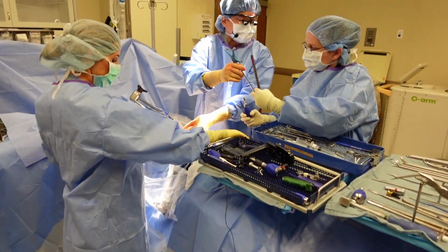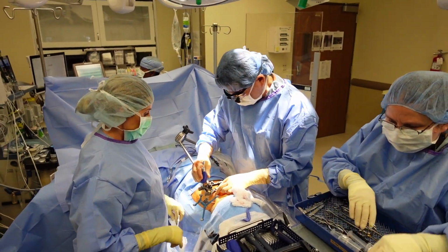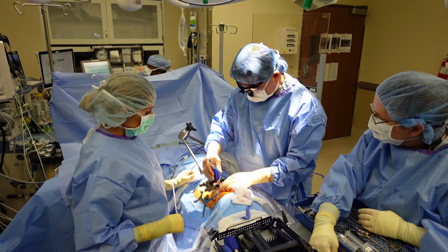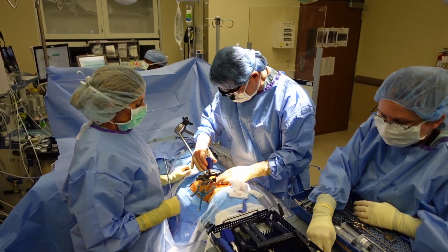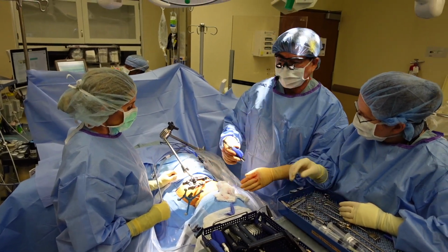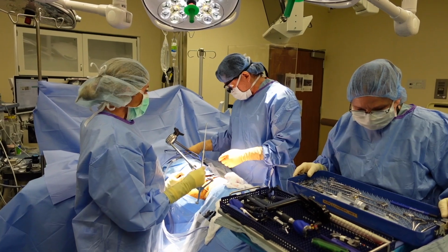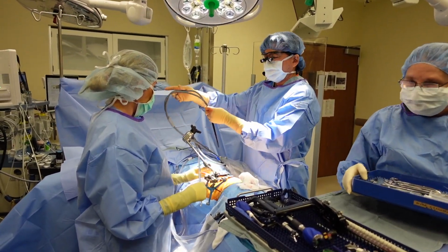Greatly decreases trauma to the psoas muscle and greatly increases the safety of the procedure, because I can make sure that I don't grab any vital structures on the way down. Because you know what my mama always said, spine surgery would be a lot easier without blood vessels, nerves, bowels, kidneys, aorta, vena cava. What else is down there? Not much except those vital structures.